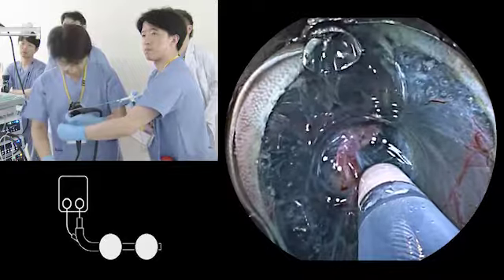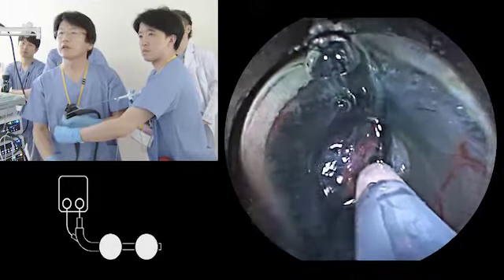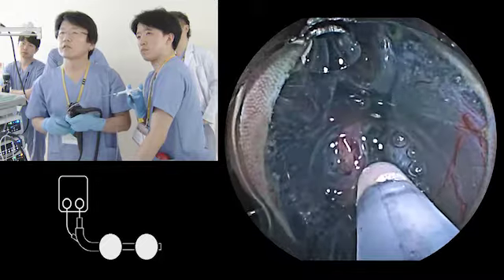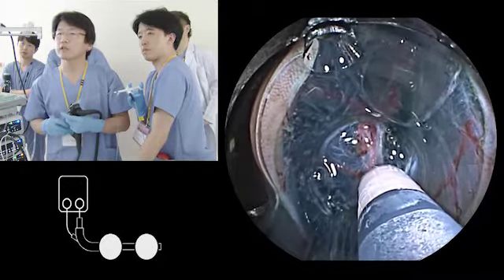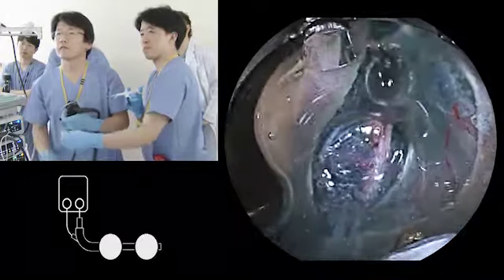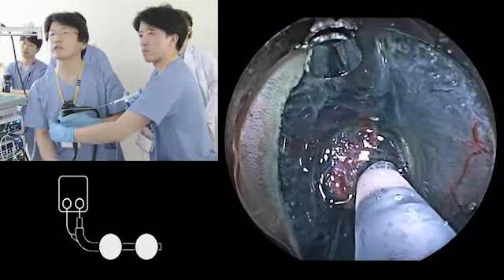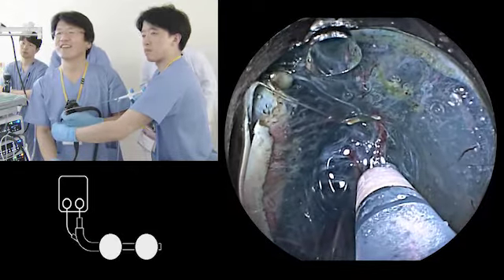Maybe you might coagulate the blood vessel if you worry about making bleeding. But I think I can separate the blood vessel from the muscle layer here. Then I can go under the blood vessel. The blood vessel is on the upper side. Yeah, I didn't coagulate because I wanted to show this very precise technique.